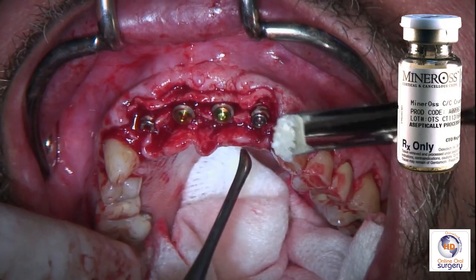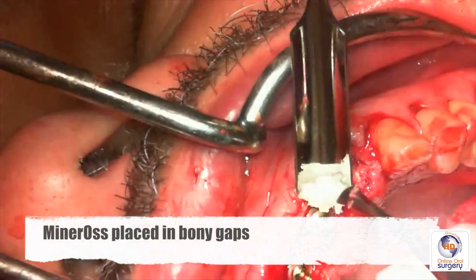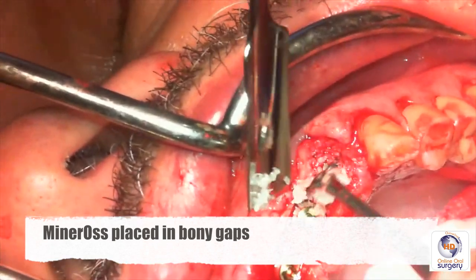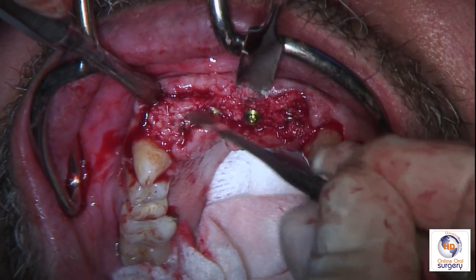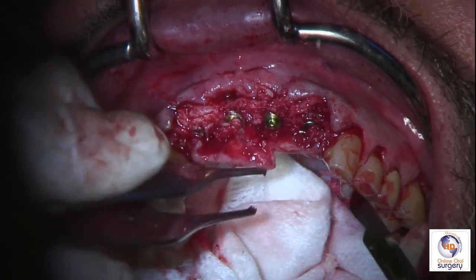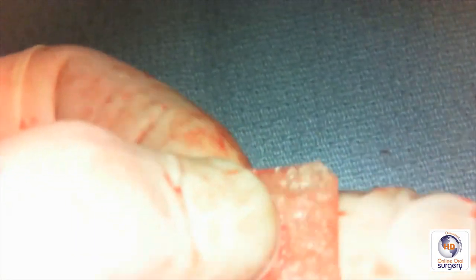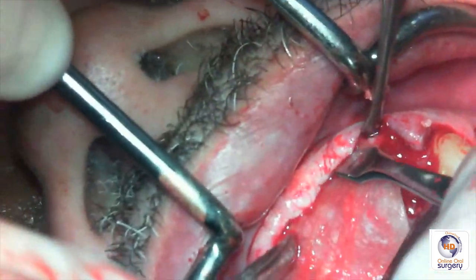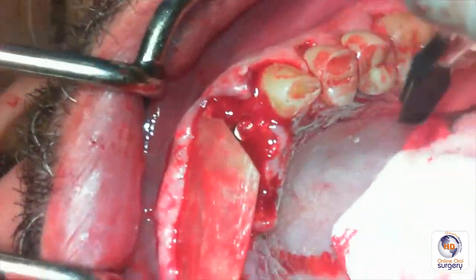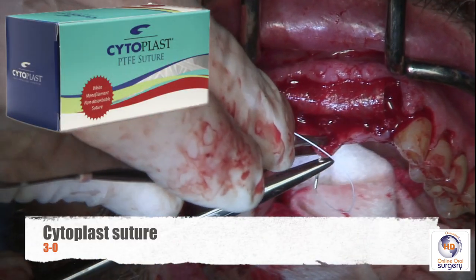To graft, I'm going to use Mineros corticocancellous graft, and then I'm going to pack that into the bony gaps between the implants and lateral to them, compact that down in place, and then make sure that I can close the mucosa. I'm going to take some Memlock collagen barrier, and I'm going to trim that to the anatomical shape of the area that we're treating, and I'm going to tuck that under the full thickness mucoperiosteal flap on the buccal and on the palatal to contain and protect the graft.